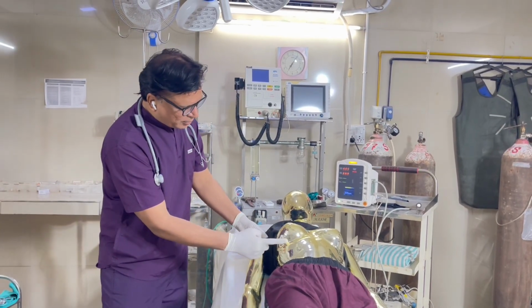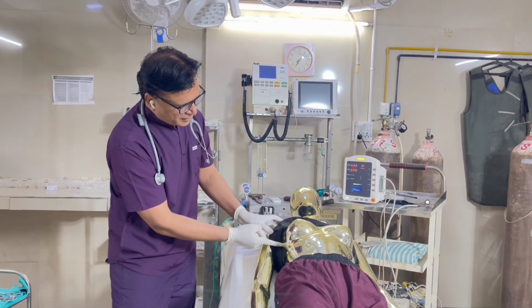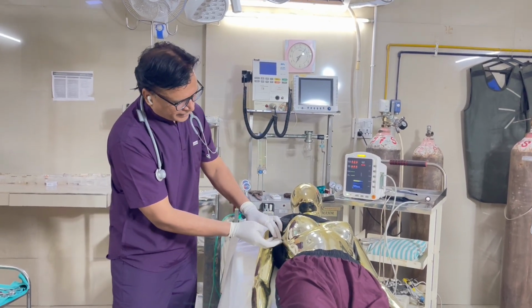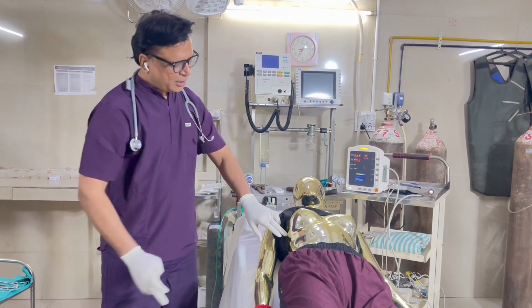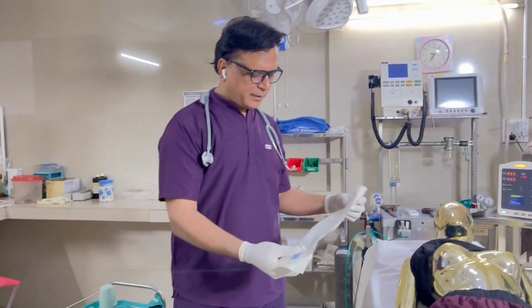In females, the lower border of the breast will be the lower border, and anterior will be the pectoralis major. In males, this is the anterior border of the triangle, this is the posterior border. Now, I will be just checking the drain.